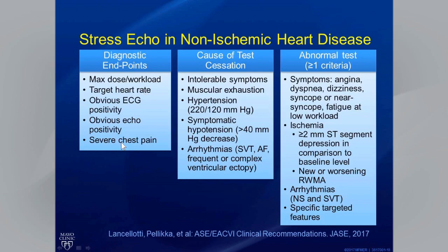In our laboratory, we really like the patient to exercise maximally until they're exhausted, and so we tend to not stop for any particular heart rate threshold. If we're doing a pharmacologic test with dobutamine, then the target heart rate and maximum dose become important.